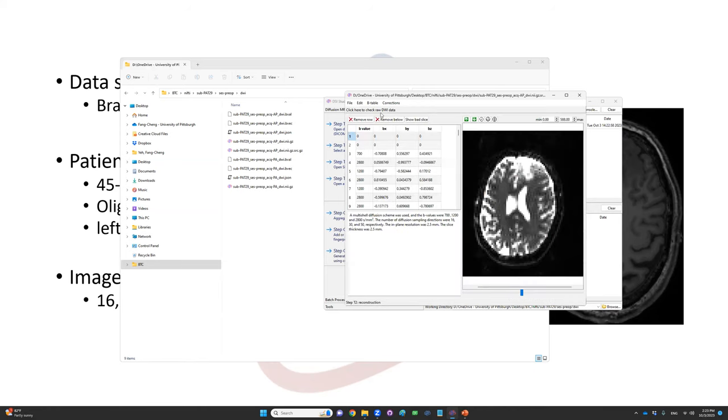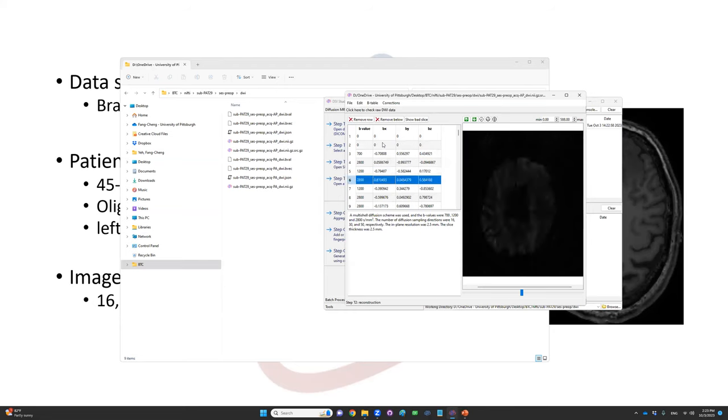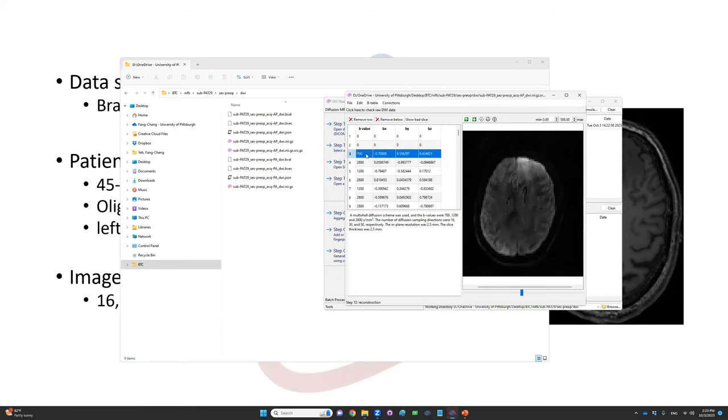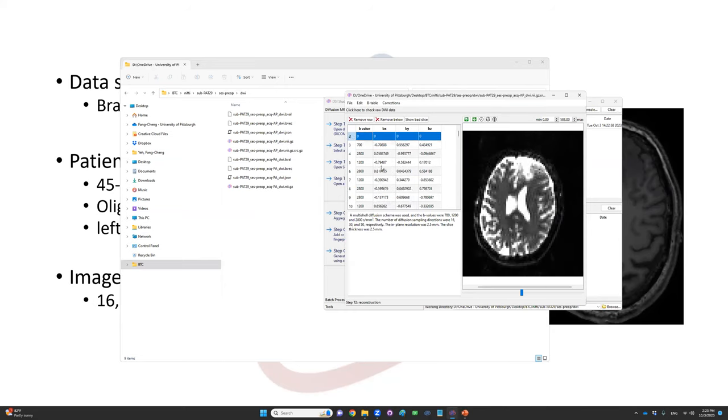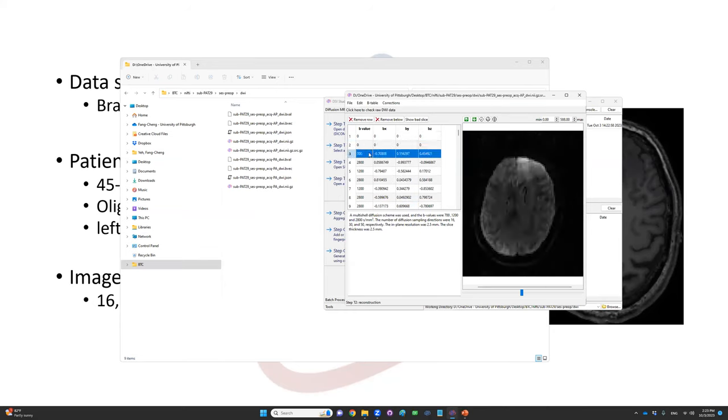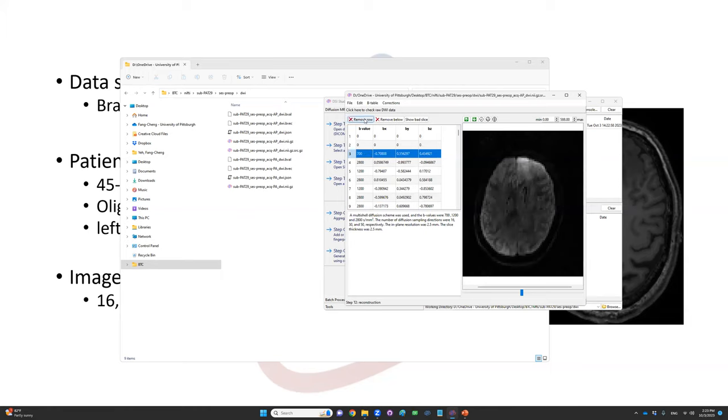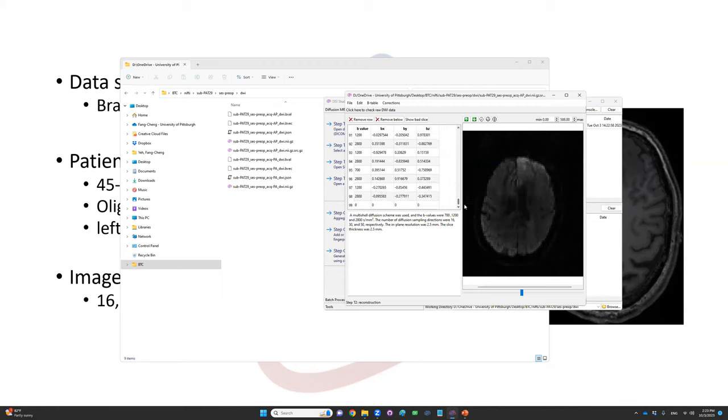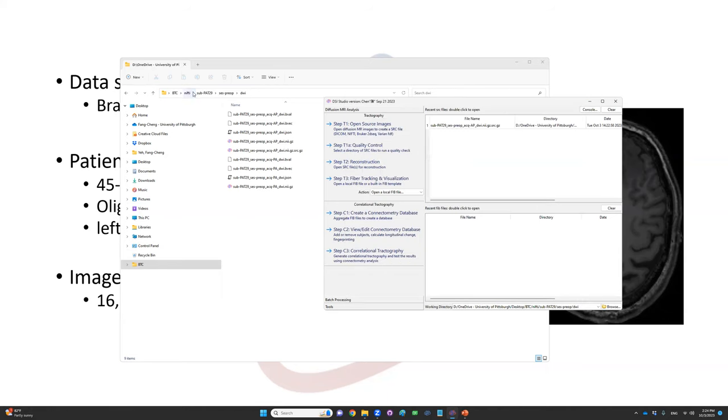Click on this tab, you'll see the different b-value data showing up here, including b-zero data. The low b-value is 700, higher b-value around 3000. For a fair comparison, we'll remove the lower and higher b-values using the remove button. We'll repeat this and only keep the b-value around the DTI acquisition range to simulate how DTI acquisition looks.